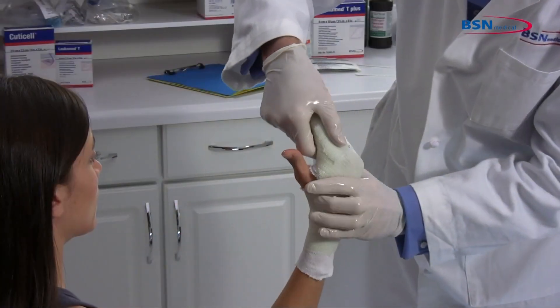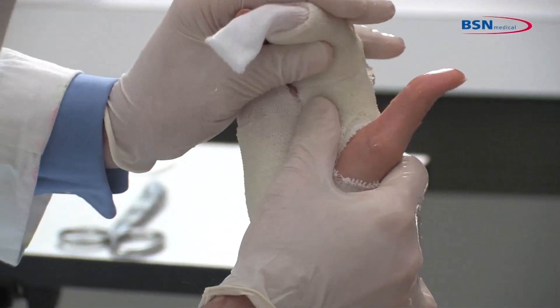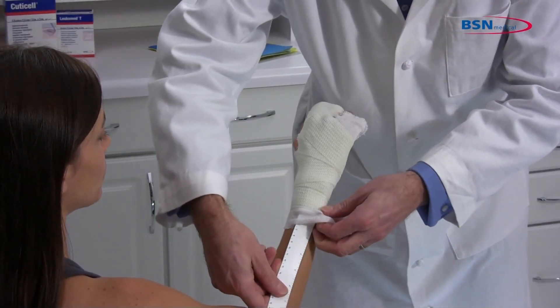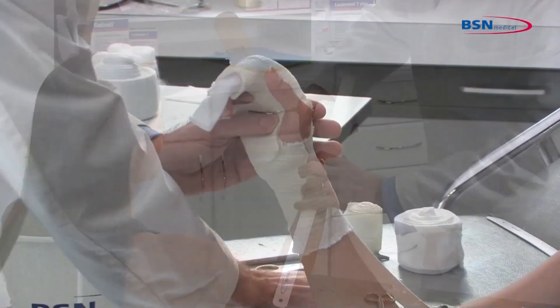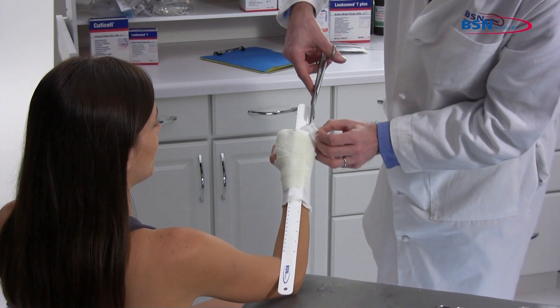Position the second and third phalanges. Before the cast tape fully sets, insert a zip stick along the dorsal surface of the hand. Allow the cast to initially set and cut off along the zip stick.